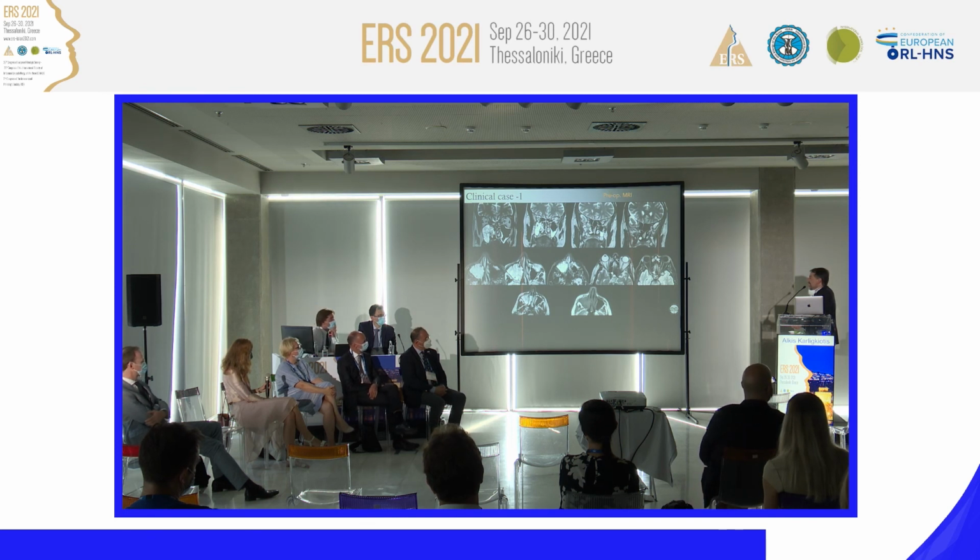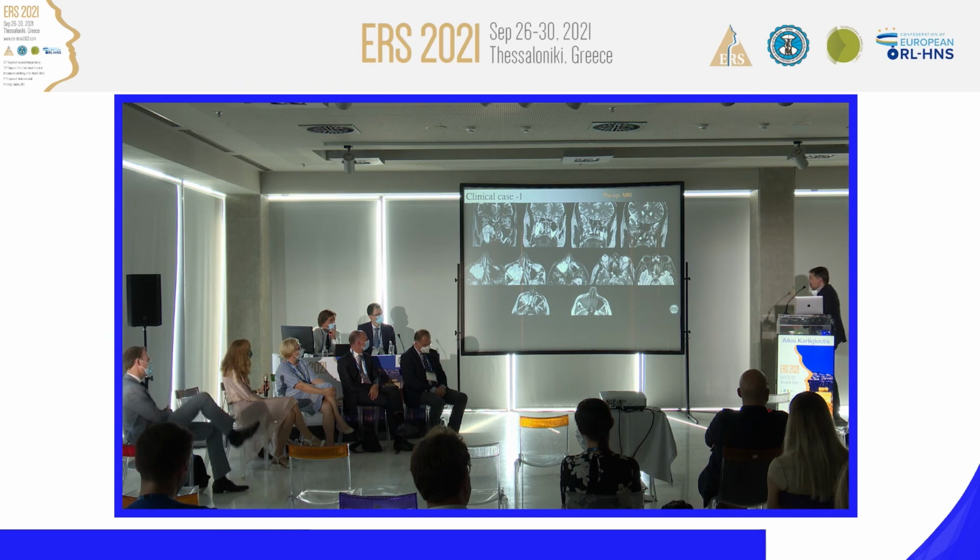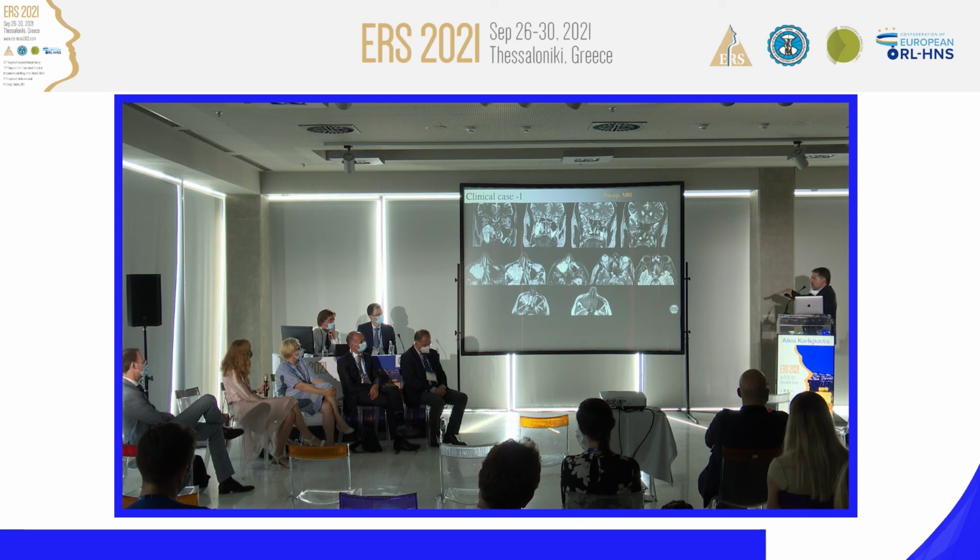Regarding the first issue, I try to send as much as I can to the pathologist, the big piece of tumor, so they have more material to check and find out if maybe sometimes there could be some malignant foci inside. And pathologists are always happy to have a lot of material to analyze. Then once I have a good piece and I'm satisfied with the tumor, I go to debulk the tumor to do a shaving. Somebody in the past, I think, was suggesting to do the sampling of the container, of the suction, of the blood and everything, and to do filtration, but I think it's impossible and nobody is doing it.